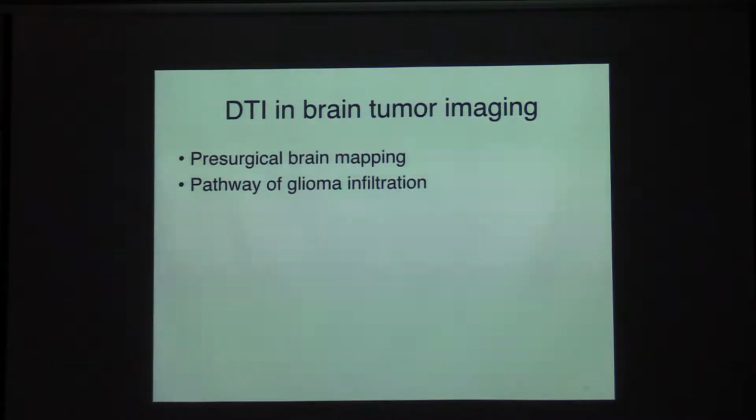So let's say you have a lesion in the occipital lobe, right? The tumor can spread locally, but it can also spread along the optic radiation, for example, and get in front into the thalamus. So that's a really simple concept, right? But what I do with my residents and fellows is that a lot of them don't know the anatomy of the white matter, and this becomes really important. You need to know white matter anatomy to try to figure out where that tumor could be. And we have had countless cases, some of which I saved, so I'll show you one or two of them, where we were able to find distant lesions just because we knew white matter anatomy. So this is basically the primary point of this talk.